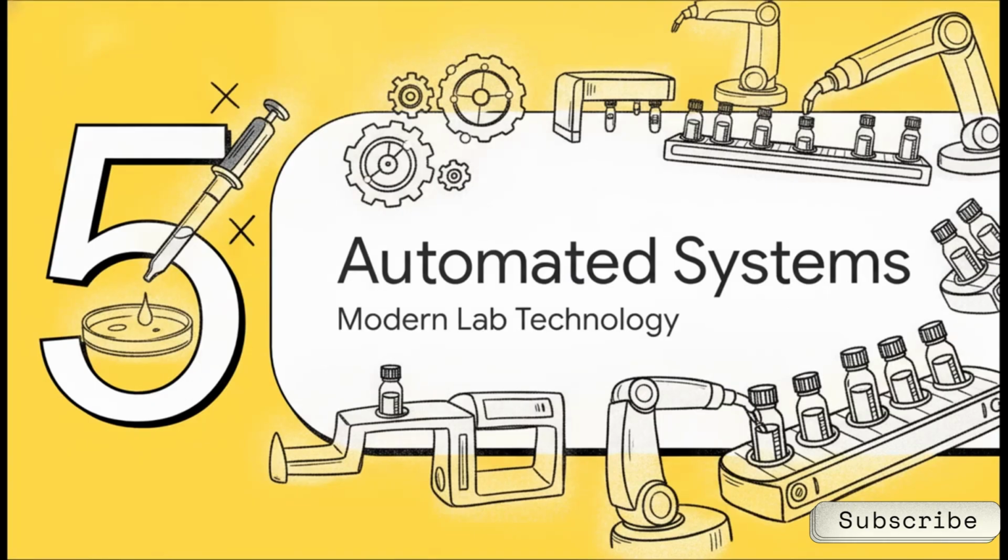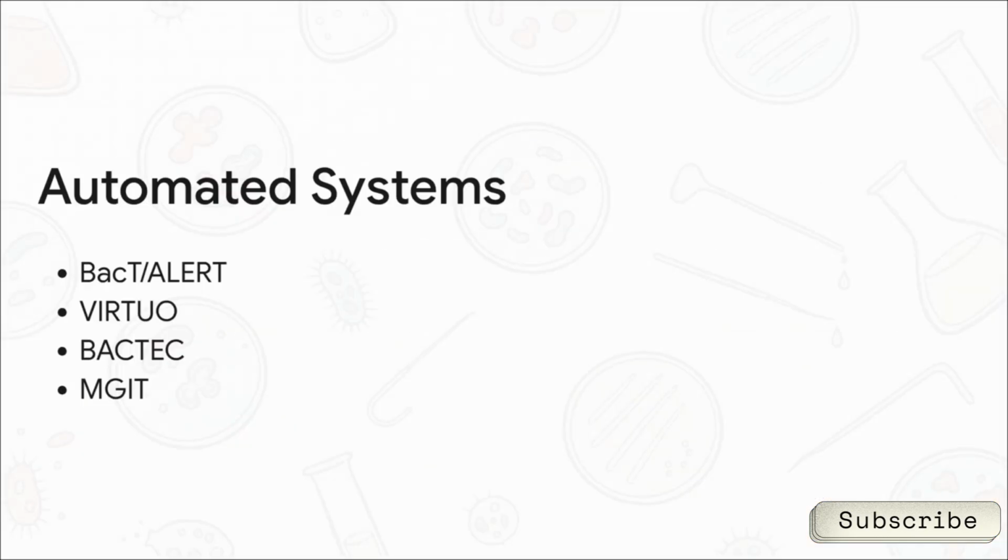Moving on to Section 5, Automated Culture Systems. Let's leave the old-school manual methods behind for a second and look at the tech that's completely revolutionizing modern microbiology labs, especially for blood cultures. When recovering a bug is really tough, like from blood or sterile body fluids, we rely heavily on automated systems.